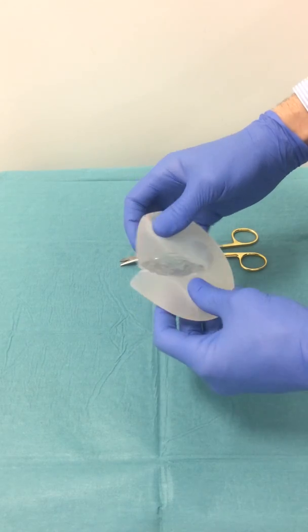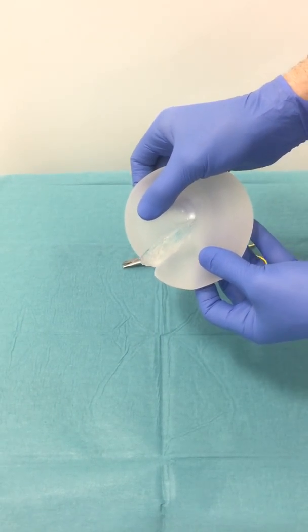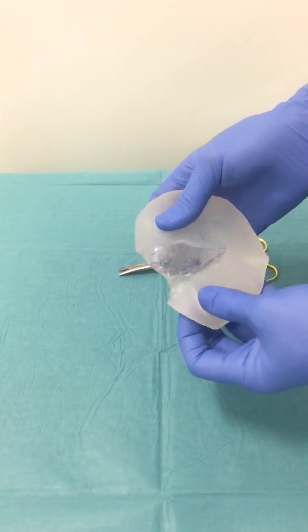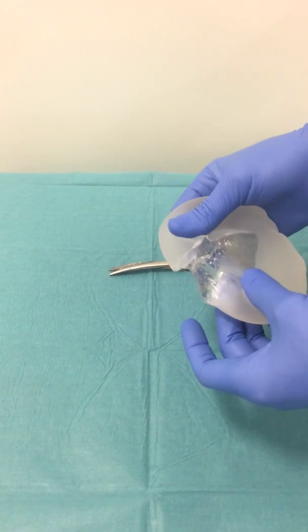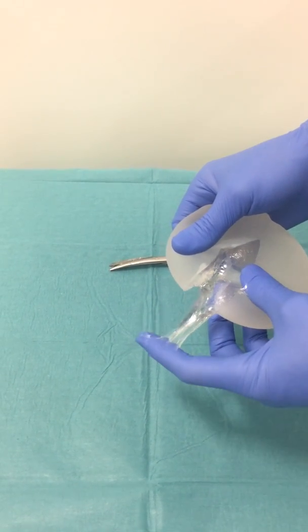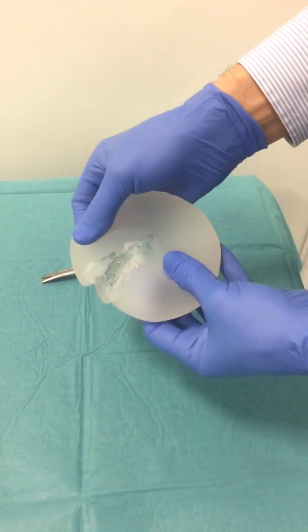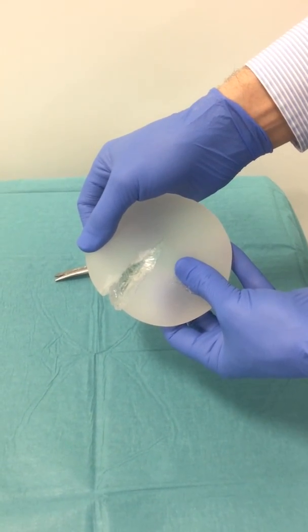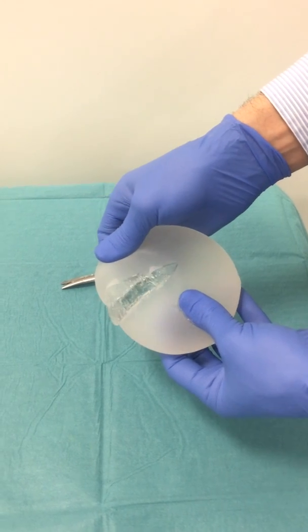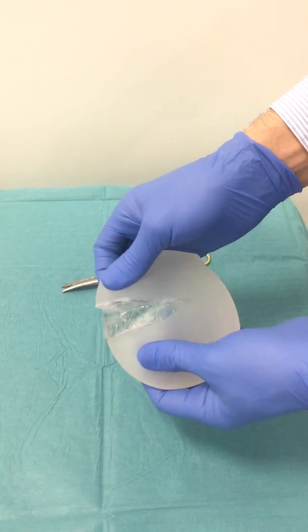So you can see it's not a liquid inside. This is what they call cohesive gel. It doesn't run out. There's a bit of tackiness to it. So if ever the implant ruptures it doesn't run out, it stays in that form and maintains its shape.